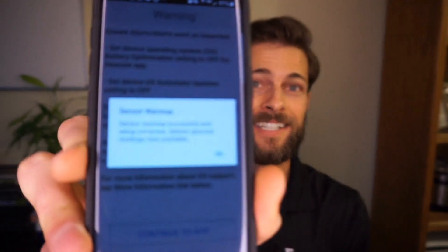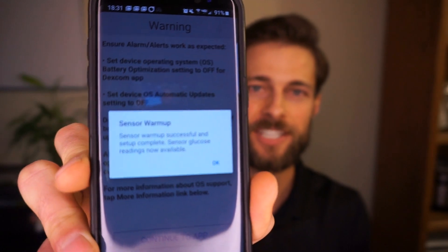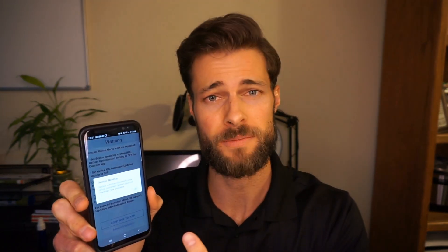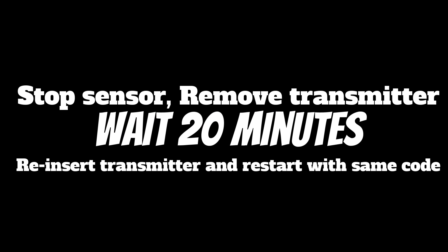Oh my goodness guys — it worked! See that? It's got sensor warm-up complete. Oh my goodness. Alright, I'm going to hit this button. It says okay. Don't judge me on whatever blood sugars are there — this has been a very stressful day. But it works. That's insane. I'm going to put something up so you guys can see the steps one more time, and I'm gonna hit okay.